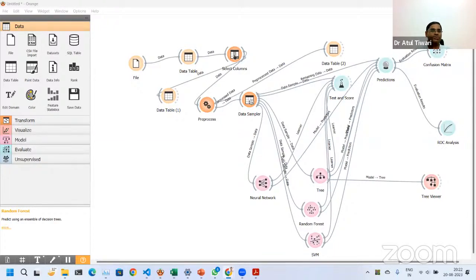But nowadays there is a technology named GAN, generative adversarial network. If you search on Google Scholar, you can easily find that algorithms have been created. They are in the validation phase, to create our own ER slide from an H&E slide. From the H&E itself, they can predict what the patient's ER slide would look like, and similarly what the PR slide would look like. And the models are very good.